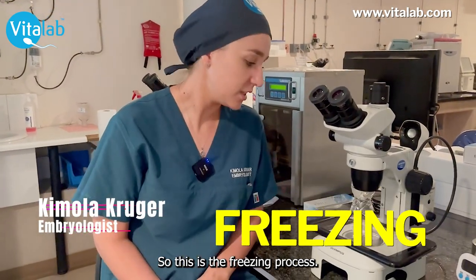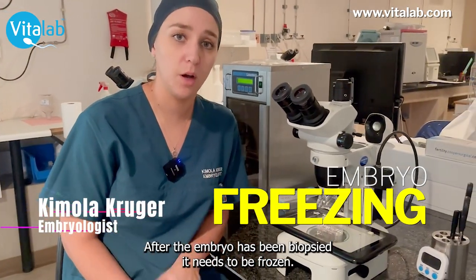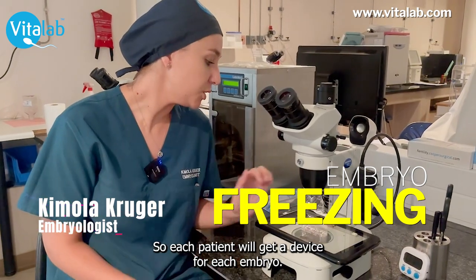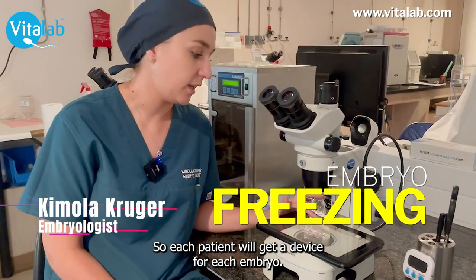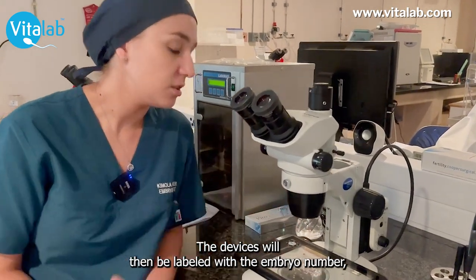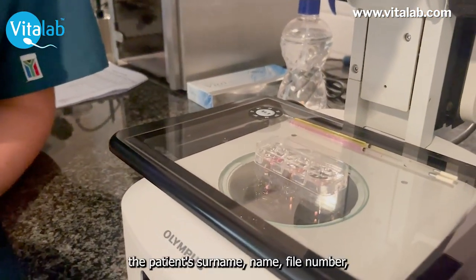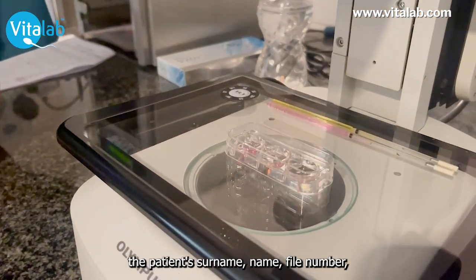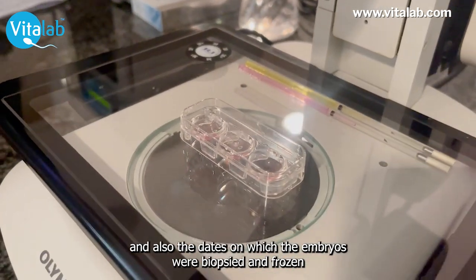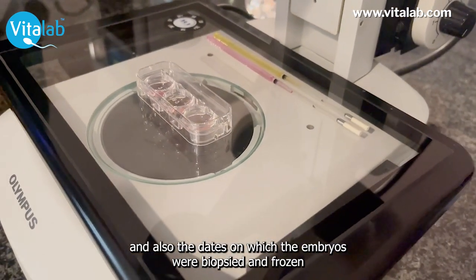So this is the freezing process. Once the embryo has been biopsied, it needs to be frozen. Each patient will get a device for each embryo. The devices will then be labeled with the embryo number, the patient's surname, name, file number, and also the dates on which the embryo was biopsied and frozen.